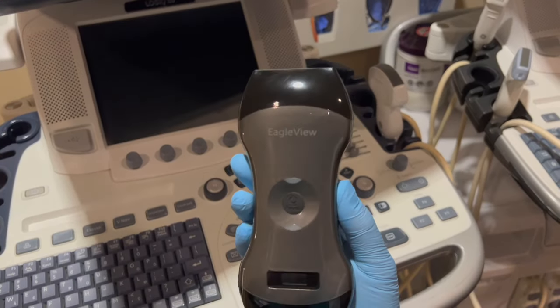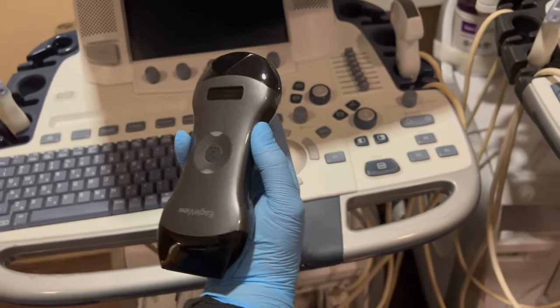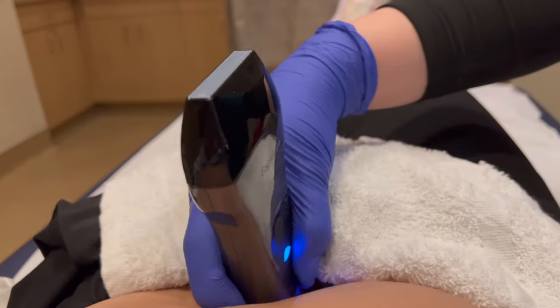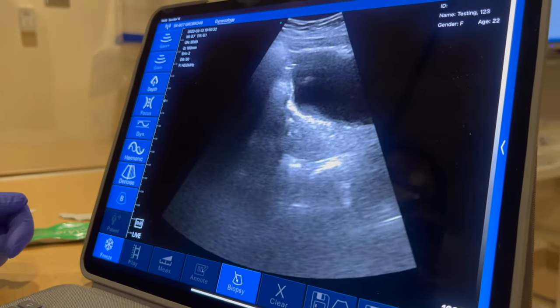I think you guys will really benefit from purchasing one of these probes. I love that it's portable, wireless, easy to use, and can be charged at any time. It's great for emergent situations. It is almost identical to using a machine — however, remember it's not an actual machine, so you can't expect it to perform exactly the same. Because it's wireless, it is limited in certain capacities and won't have all the easy buttons of a full machine, but it is easy to use for what it is, and I highly recommend it.